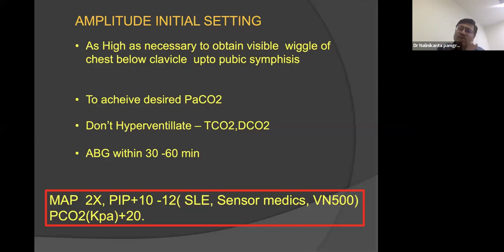With that, probably 2 clues. One is values with a formula, knowing the previous setting in the conventional ventilator, and observing the baby at the bedside, we can know whether there is adequate wiggle in the baby. And why are you choosing the wiggle? Adequate ventilation should wash out the carbon dioxide, and within 30 to 45 minutes this ventilation affects the blood gas.